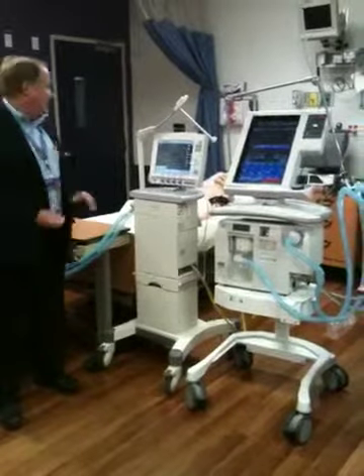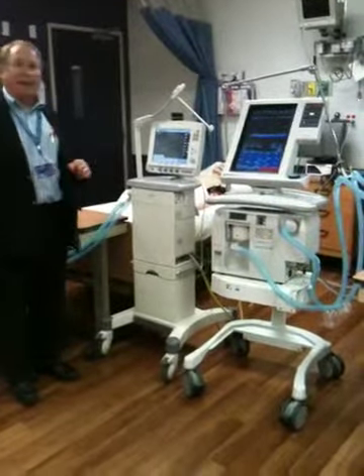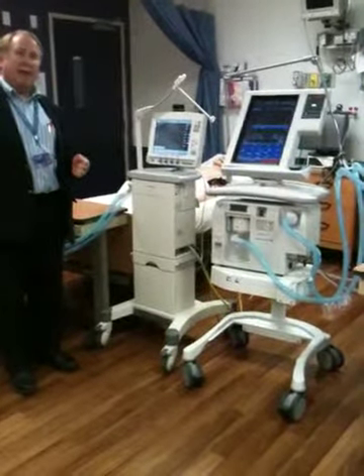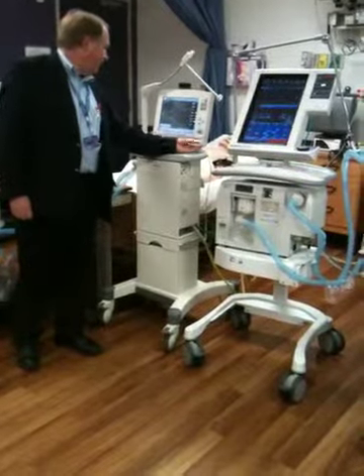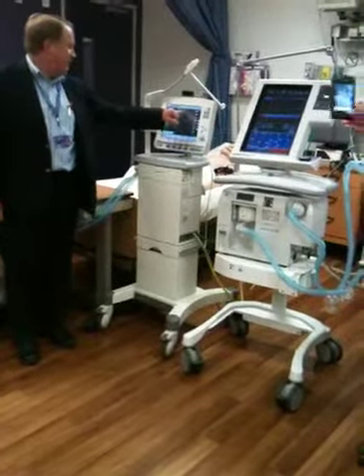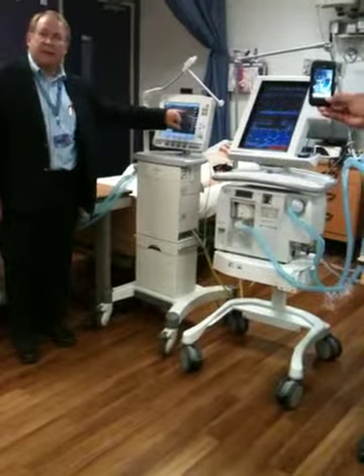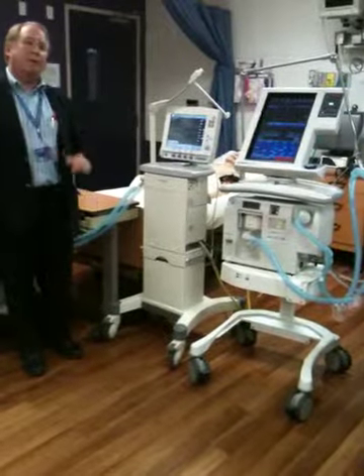Now the one thing is, on this particular ventilator, it's not going to give me a static compliance, it gives me a dynamic. To get my static, I need to have a plateau. So it has here, and the plateau is, you see it come up to the peak on the pressure here. It holds for just a second and then drops down again. But it needs a solid one, it needs it over a period of time to calculate.